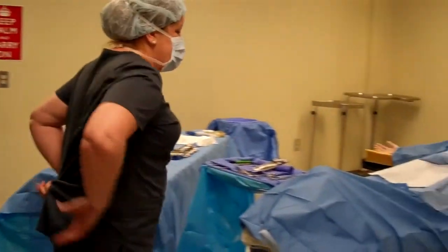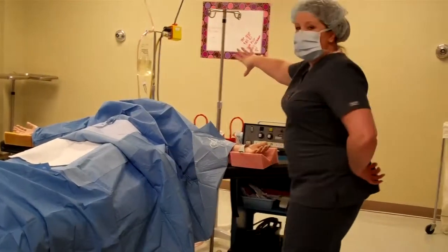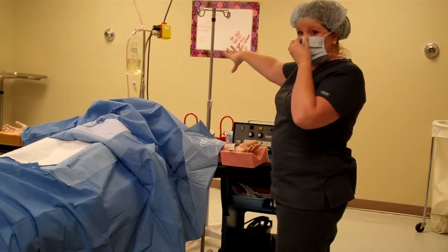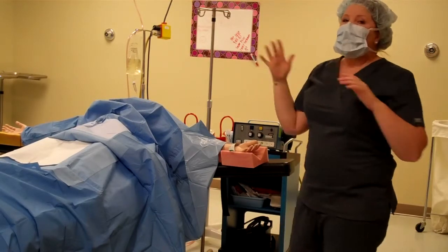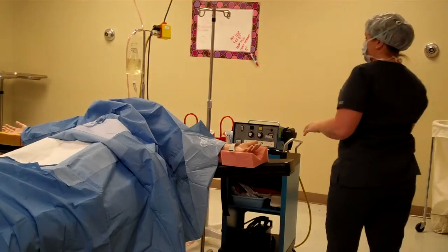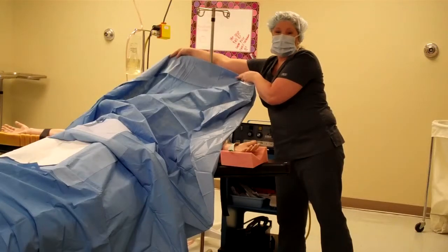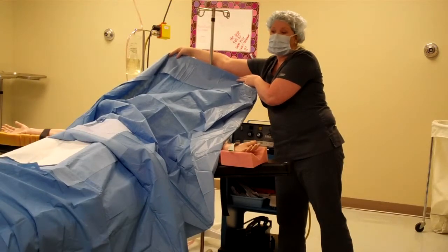That would be over the patient. But once you're up here at the top of the patient, at the patient's head with the anesthesia, it doesn't matter, okay? Because this will be covered for the screen for anesthesia and for you, okay?